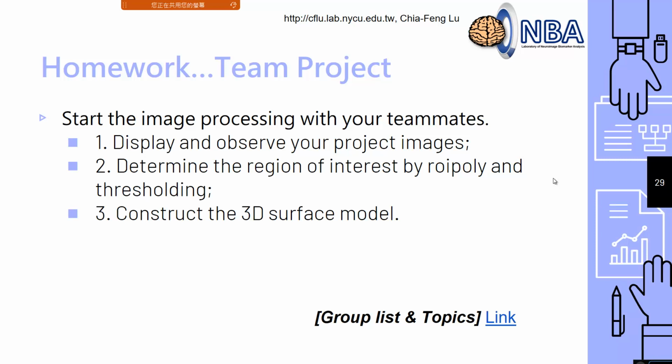But again, the detailed instructions for all the groups will be mentioned next week. Today I just want you to make a quick test on your model file. Anyway, try whether you can construct any 3D surface model by yourself.